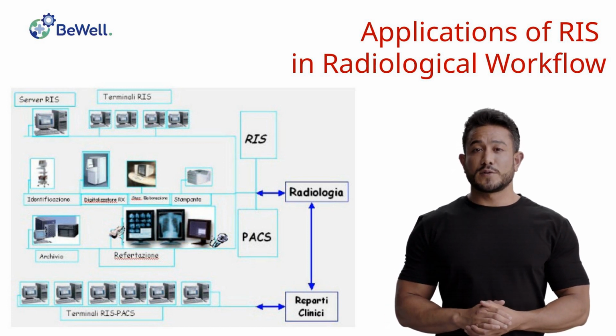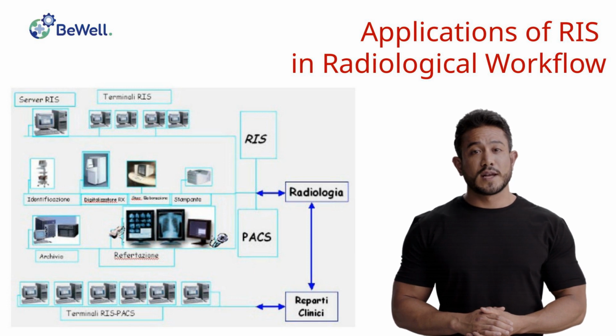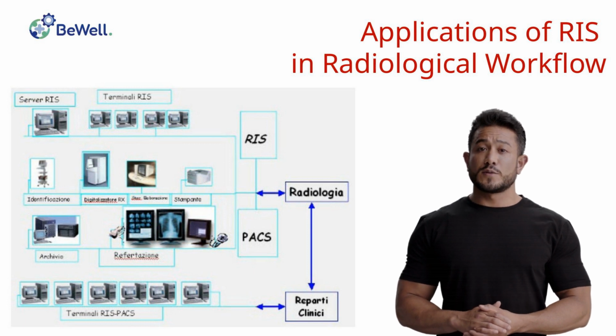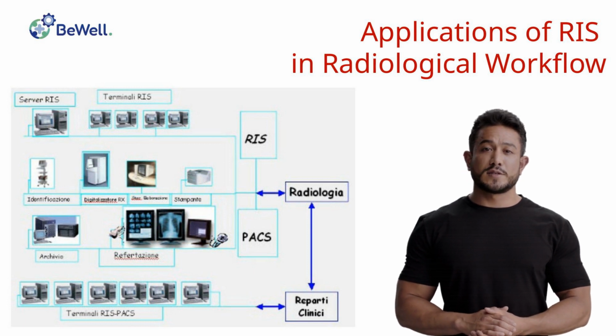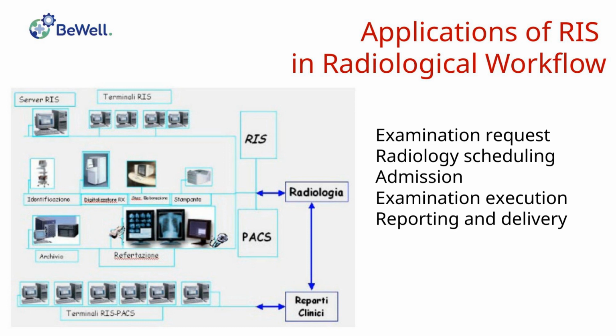Admission. When the patient arrives for the diagnostic examination, it provides an opportunity for the RIS to correct or supplement the data collected up to that point. These pre-examination data may also aim to refine the authorization process for the examination, which is only performed after verifying the appropriateness of the examination and excluding any relative or absolute contraindications.